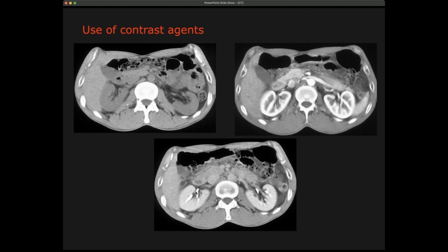But now there's white in the middle of the kidneys, and this is of course your urine channels. What happens is that the kidneys have taken the contrast out of the blood, and it's being put into the urine. So there you get the contrast.